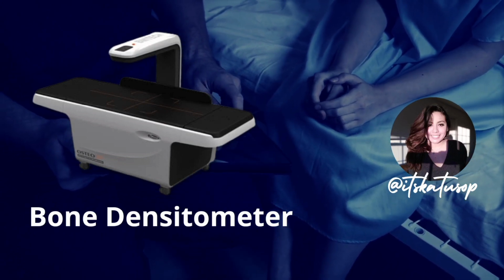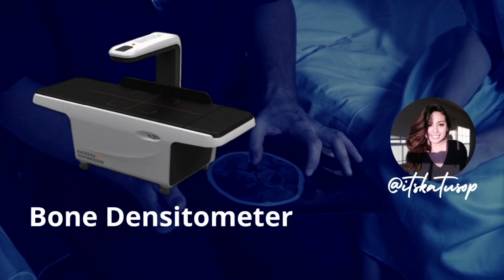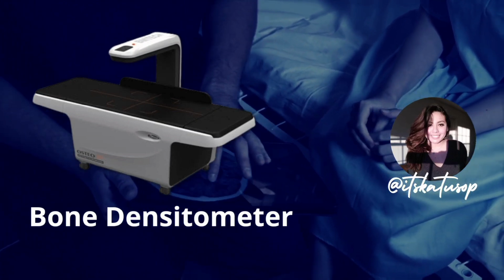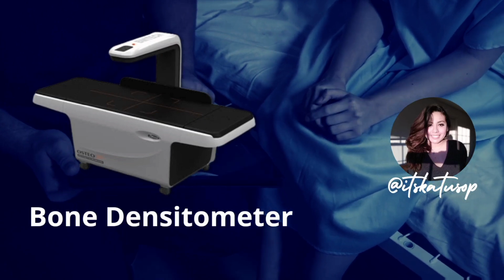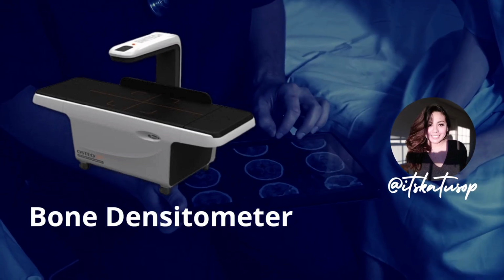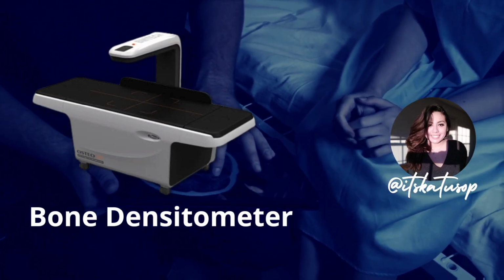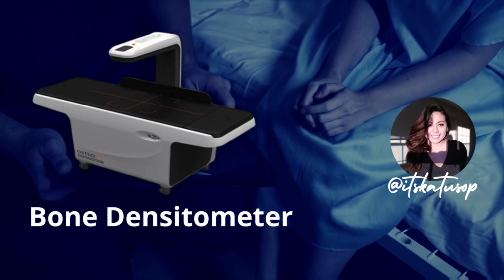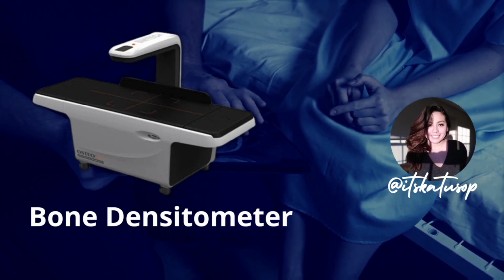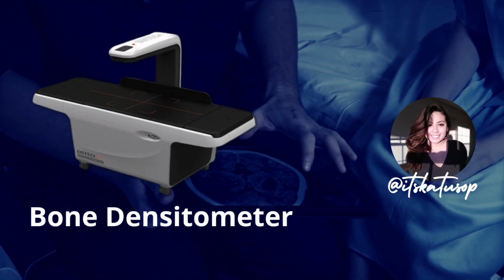What is a bone densitometer? A bone densitometer is a medical device used to measure the density of the bone. The most common type of bone densitometer is a dual energy X-ray absorptiometry, or DXA, scanner. DXA scanners use low-dose X-rays to produce images of the bones.